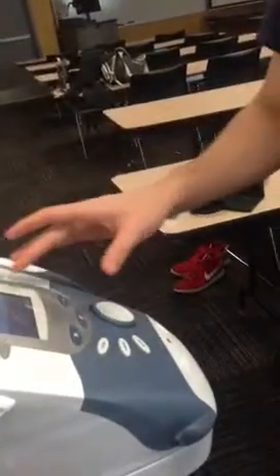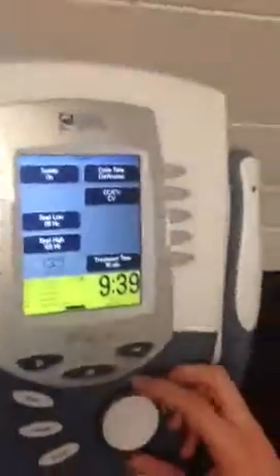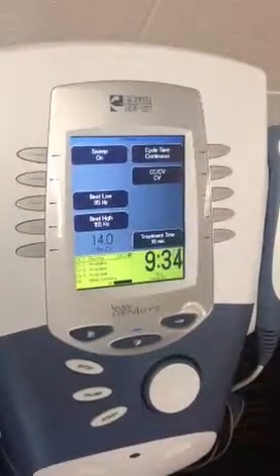Okay, so we've got the treatment time at 10 minutes. We've got a cycle time continuous, so it's just going to keep going. And press start button to start the treatment. And during this, if the patient begins not to feel the stimulation from the treatment, you can always adjust the treatment intensity with the button here. So, say he couldn't feel it at 12.5, we could adjust it to 14 where he could feel it more.